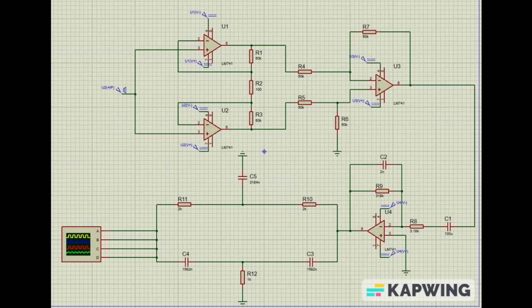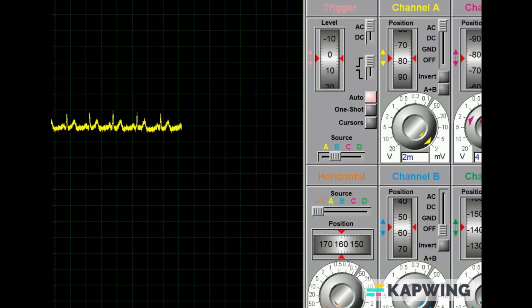The process involves taking a noise-enhanced .wav file from an audio streaming site and loading it into the Proteus simulation software. And here, in order to see the oscillation, we connected an oscilloscope to the whole circuit, and as expected, an ECG signal appeared. Despite the distorted and noise-enhanced nature of the source file, it was still possible to extract the characteristic P-wave, QRS complex, and T-wave of the ECG signal, which is a significant achievement.